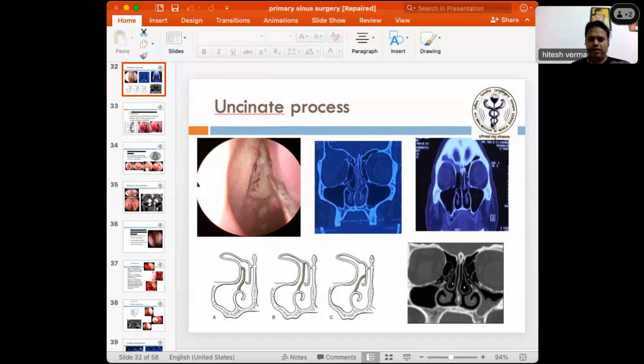So the anterior to posterior approach is basically used at the first surgery. At a second surgery, that can also be used if anatomical landmarks are there. If anatomical landmarks are not available, in that case the posterior to anterior approach is used. In that case the choana is first identified, then the surgeon goes to the sphenoid sinus, identifies the skull base and follows it anteriorly.